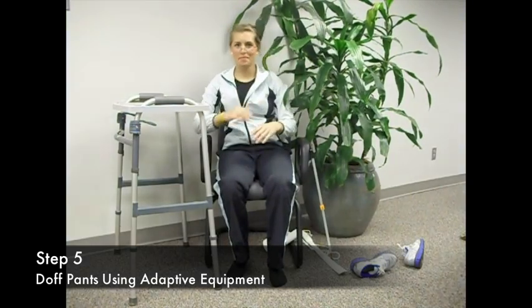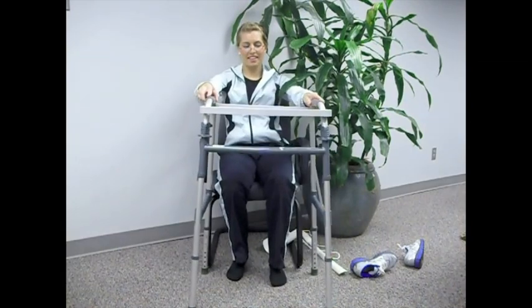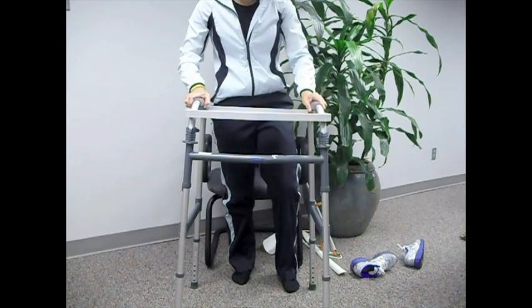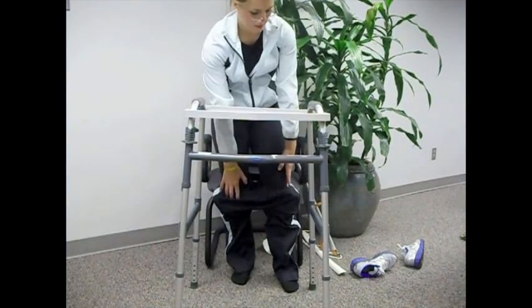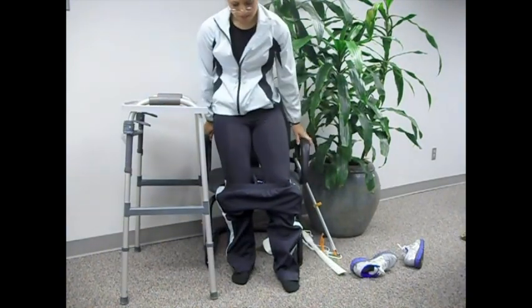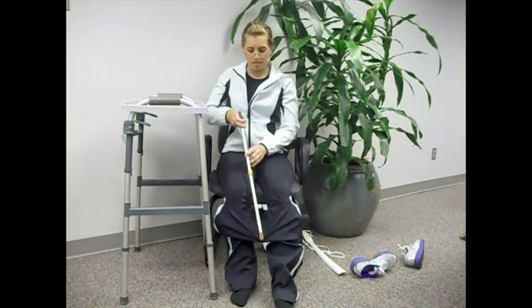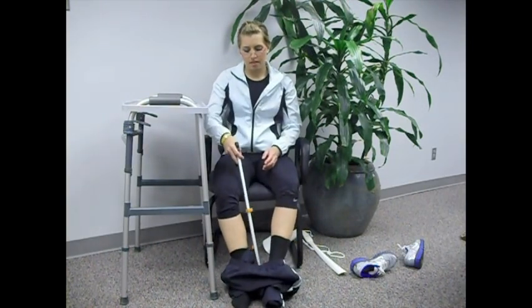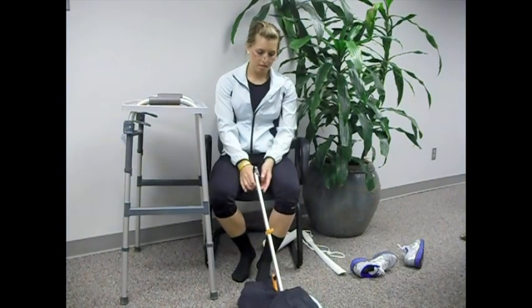Next, we will discuss removing your pants. Bring the walker around in front of you, then slowly pull your pants off to your knees. Move the walker aside. Descend into the chair on your unoperated leg, then use the reacher to push your pants off of your legs. Move the pants aside — there you go.